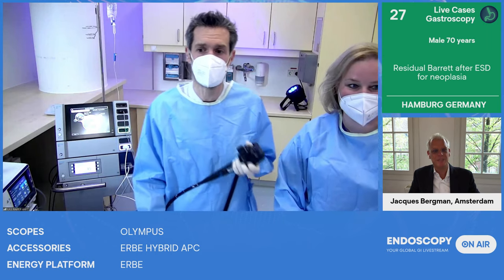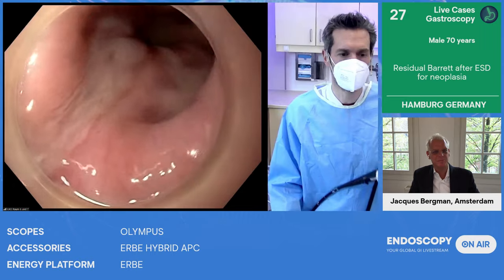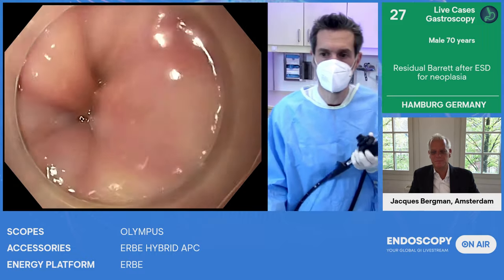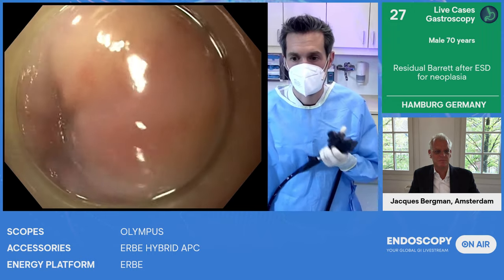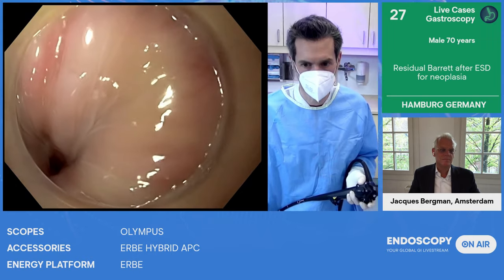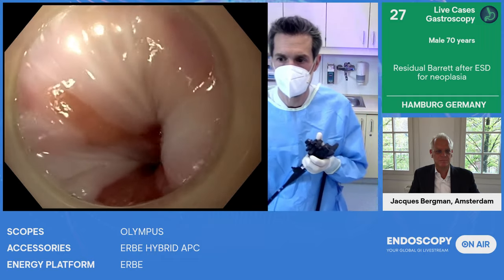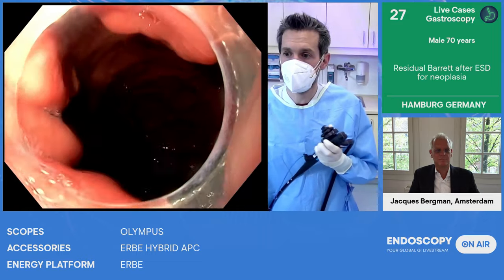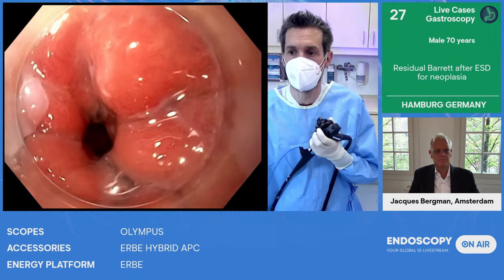Philip, good afternoon. Can you hear me? Our patient, can we have the endoscopic image? He had an ESD in 2016 because of a low risk adenocarcinoma, Barrett's esophagus carcinoma. And in the time after that, he had more ablation therapy of the residual Barrett's esophagus. He had RFA two times and APC as well. And in the last surveillance gastroscopy, there were three small pieces of suspicious residual Barrett's esophagus described.